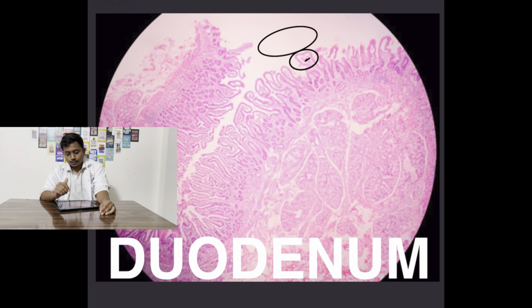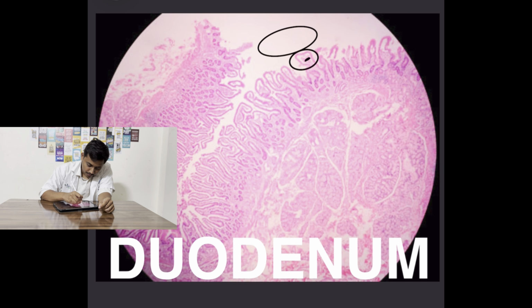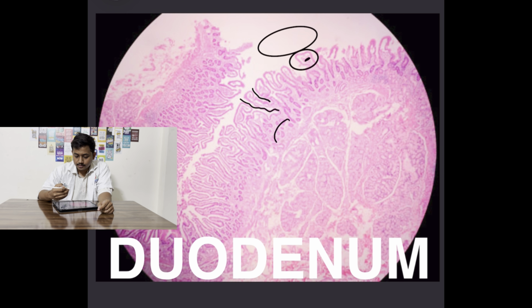The third thing that you should be looking for is the crypts of Lieberkühn. These crypts are present in the mucosa and you can easily identify them. The next thing that you should be looking for are the submucosal glands. These glands are also known as Brunner's glands, which are present in the submucosa of the duodenum.